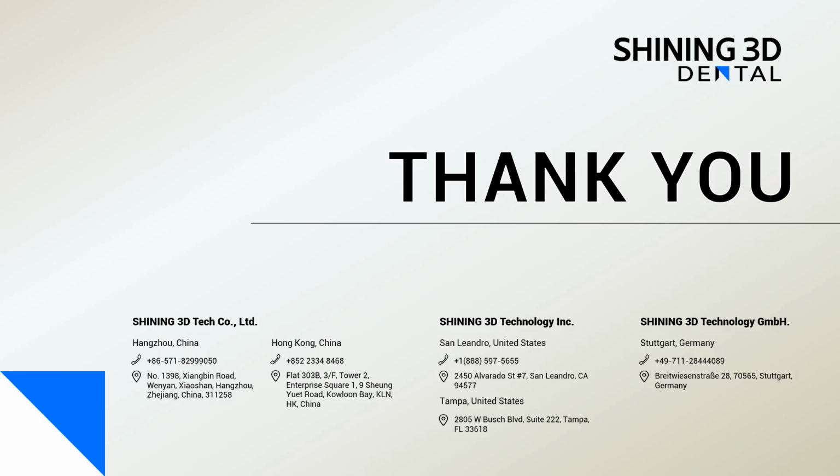This Aoralscan Elite basic training content is made based on the current version of the software. As clinical cases increase and the software continues to be optimized and updated, this training content will also be revised accordingly. Please contact your reseller or Shining3D for the latest software and training materials.